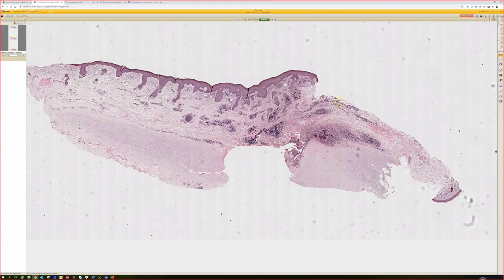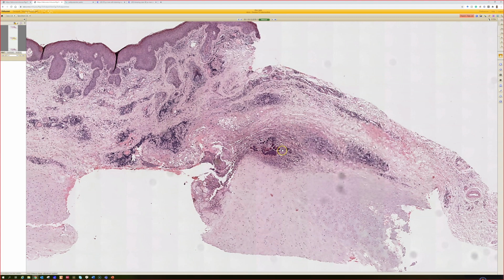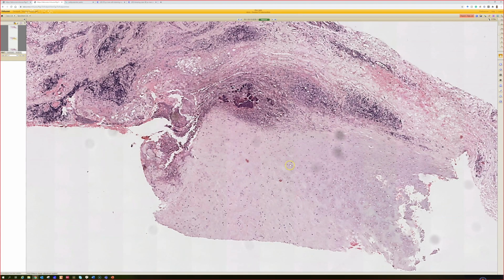All right, what's this one? Case 15. This one in the dermis, there's a purple glob. It's coming in focus here. And where are we, probably? What's this?